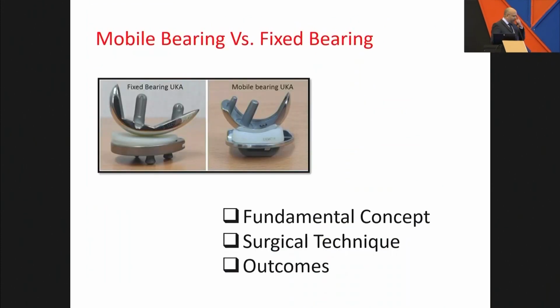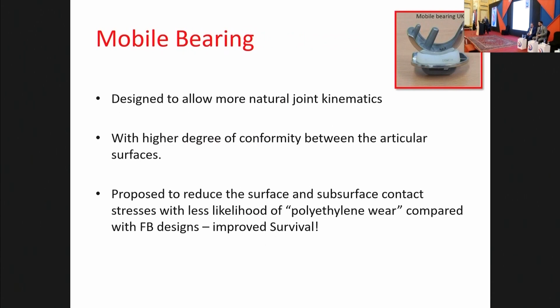So I just thought when I was preparing my talk that I should just make it clear and precise, especially because we don't do unis in Pakistan. So I thought we should discuss clearly about the fundamental concept in design, why mobile bearing and why fixed bearing, how does it affect your surgical technique, and does it really matter in terms of outcomes pertinent to these two designs.